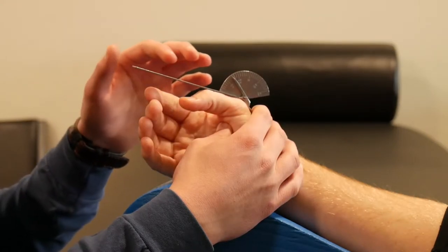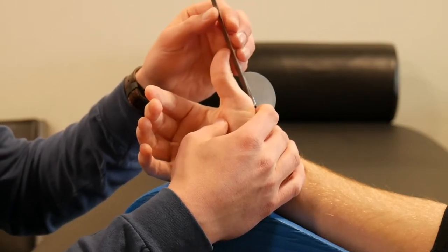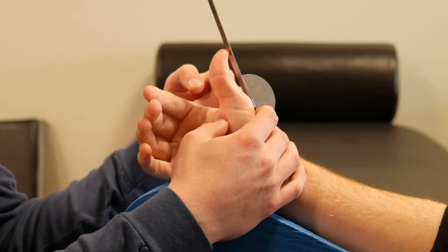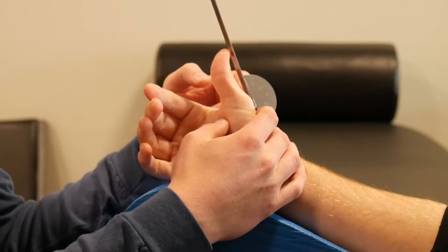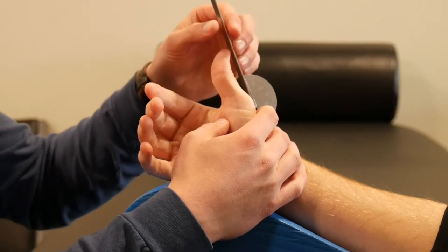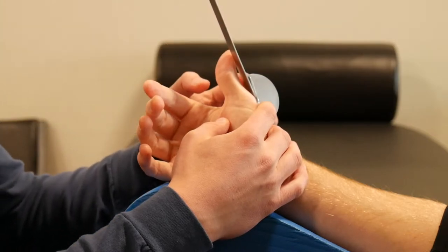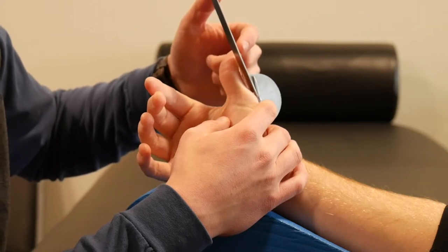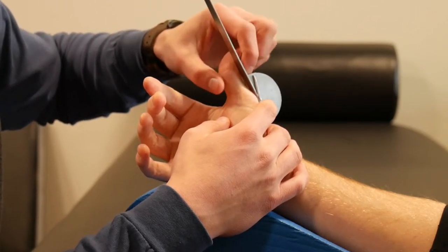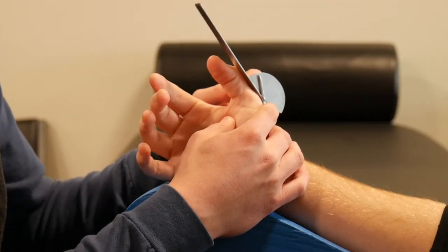For MP joint extension, it's the exact opposite — have the patient extend their MP joint as much as possible. Something interesting to note: some people have IP joint hyperextension naturally. In this case he does, and so you'll see a skewed measurement because the goniometer is lifted higher than the actual MP joint extension. You would actually slide the goniometer off the edge, keeping it in line with the dorsal aspect of the proximal phalanx, to avoid the skewed measurement caused by that IP hyperextension. Make sure the moving arm is in line with that proximal phalanx for the true extension measurement of the MP joint.